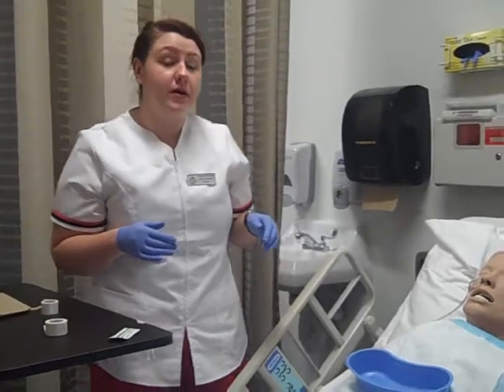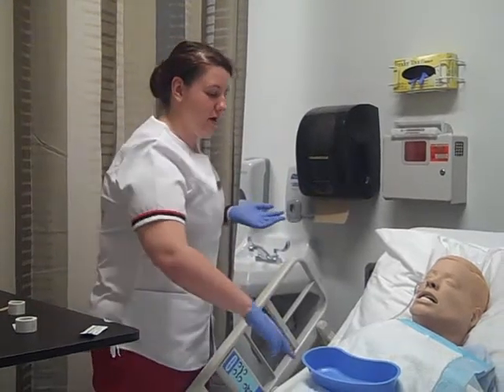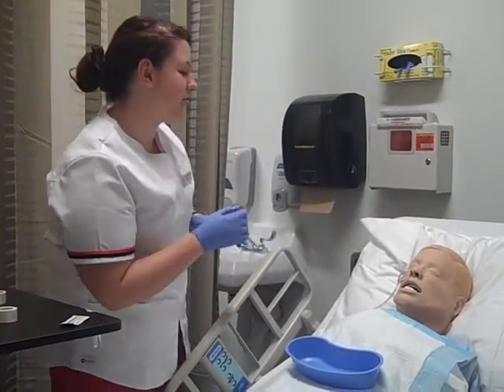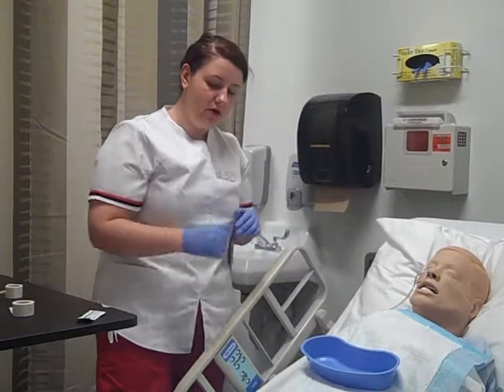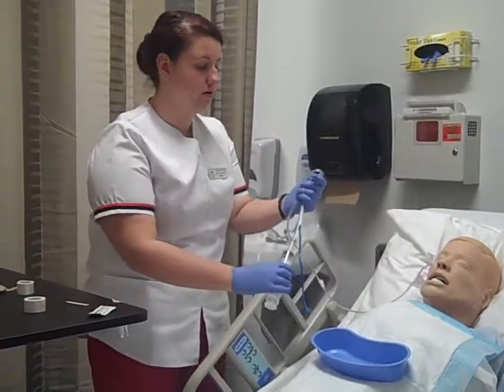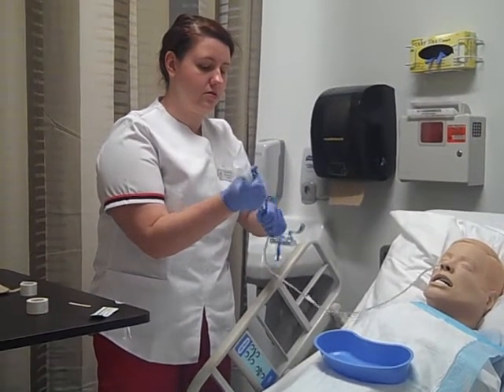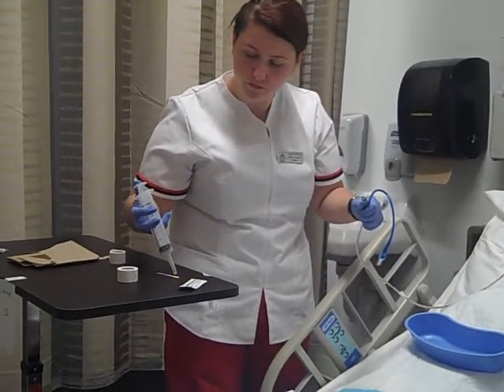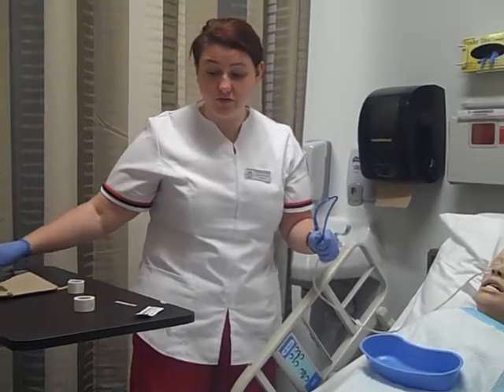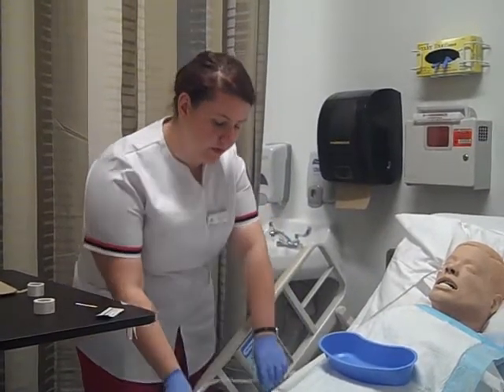For the purposes of this video, I can't get the NG tube all the way in, but in real life I would do it all the way. Can you speak for me? Just say hello. And can you open your mouth? Okay, just making sure the tube didn't coil in the back of your throat. And now I'm going to check your pH — I'm going to aspirate the tube. Very good. Your pH is in the normal range between 1 and 4, and that's what it needs to be, so it's confirmed in your stomach.